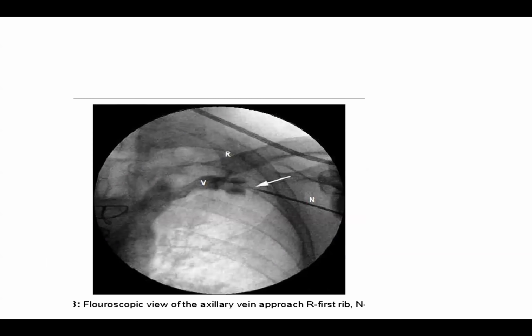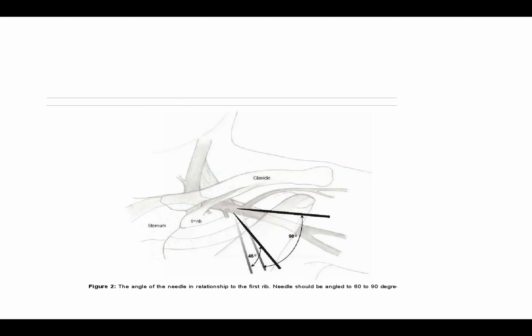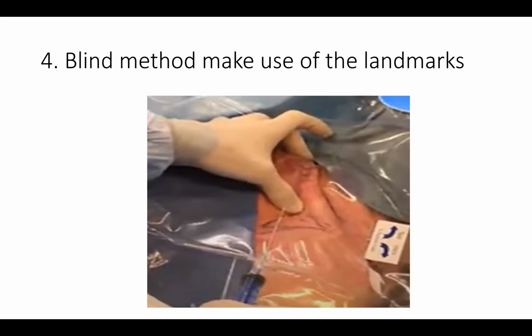Then the other method which I also want to describe here is the method of what we describe as the blind method using the landmarks. Now, the issue about blind method, this is the first method that has been invoked before all these other methods started coming up.